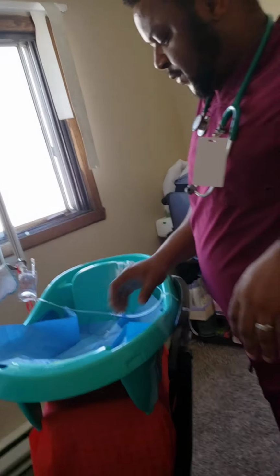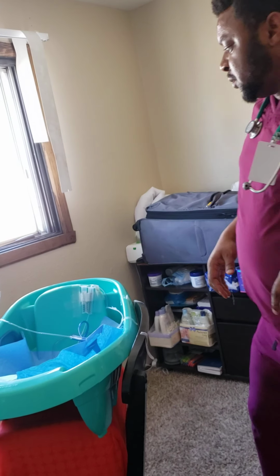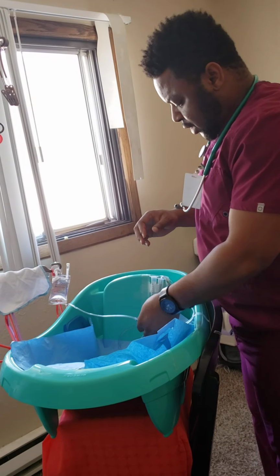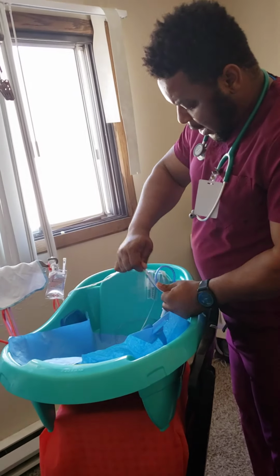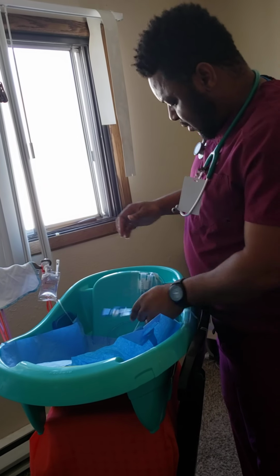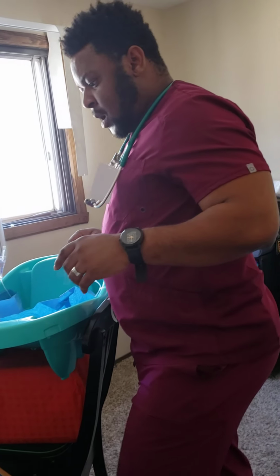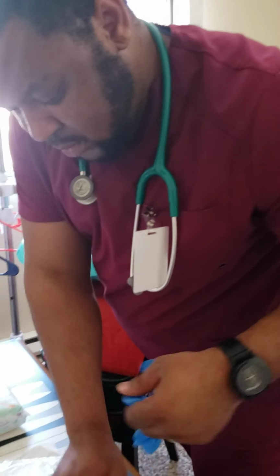After explaining everything, I'll stop my machine. I'll clamp it at the bottom, take out this tube and clamp it right there. After that has been done, I will now want to put on my gloves.